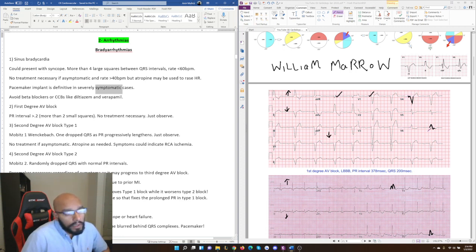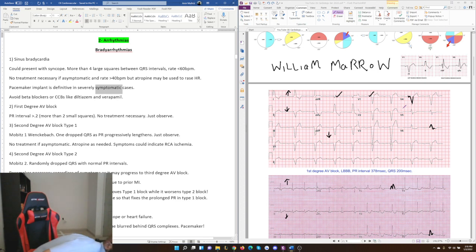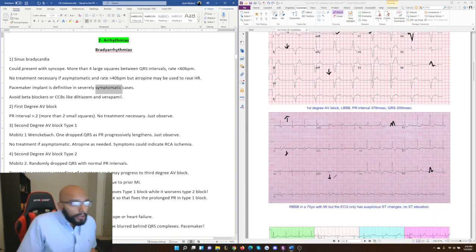So in V6, the M is pretty apparent. And in V1, you can't really see too much of the W, but by here in V2, you can see it. I traced it in V4. The point is to find it. It's never going to be extremely accurate or straightforward. It's not going to be super obvious. But as long as you can find it, you're going to be able to trace it out and figure it out. Now here, it's even better.